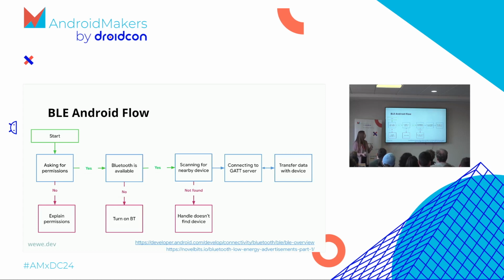To transfer this data, we're using 2 terms: GATT request to connect, to push the data from our phone to the peripheral device, and the GATT callback to listen for our data. And here is a small highlight. Only one connection at a time is available.